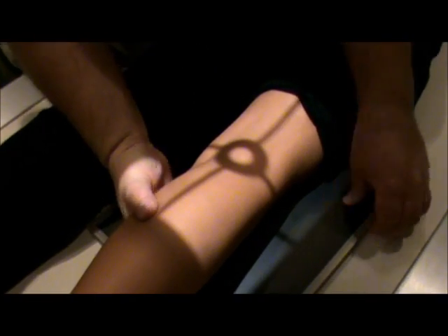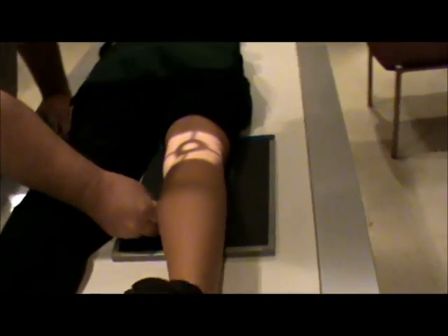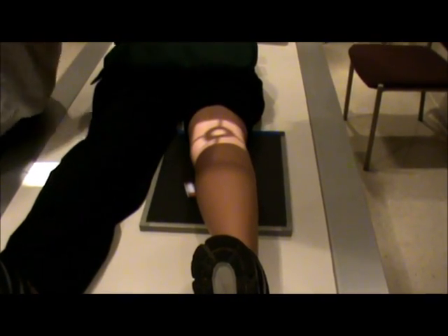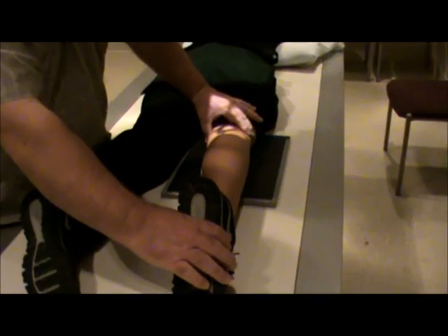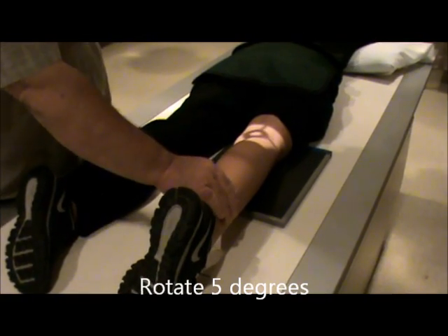Make sure that you're centered to the film both ways. The collimation will be sort of tight — four-sided collimation. There is a little bit of light where the marker can be placed on the film without obstructing anything. Technical factors again are 60 kV at 10 mAs. We do want to rotate the heel out, which actually rotates the patella in about 5 degrees to get it more into a true AP position.